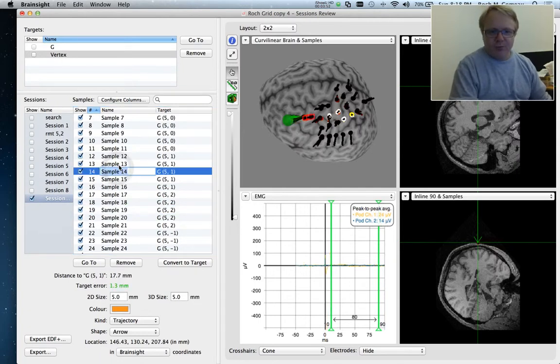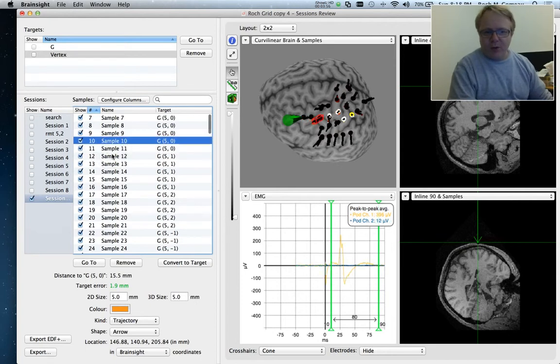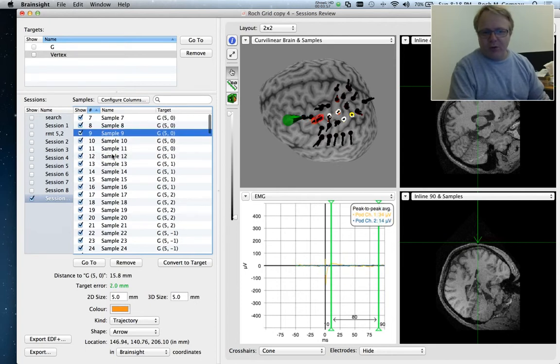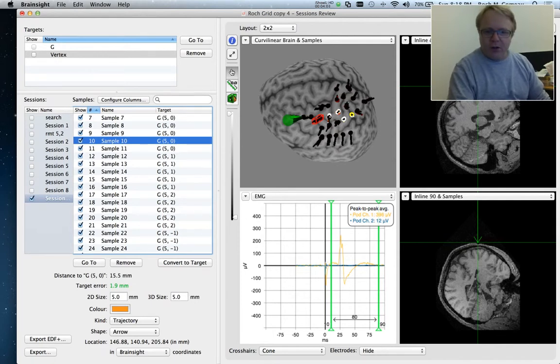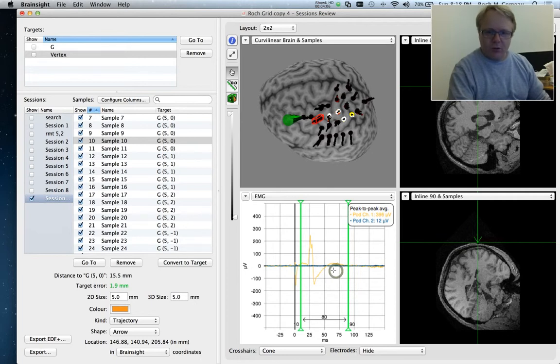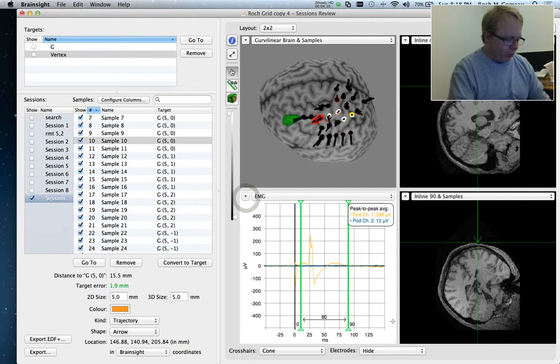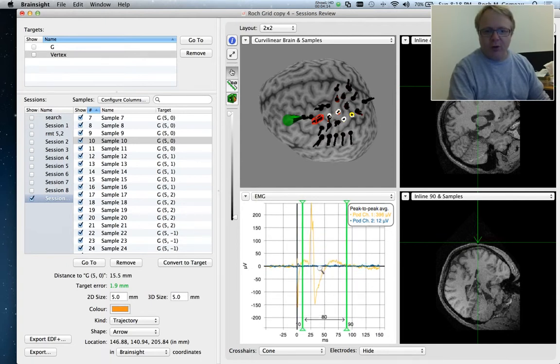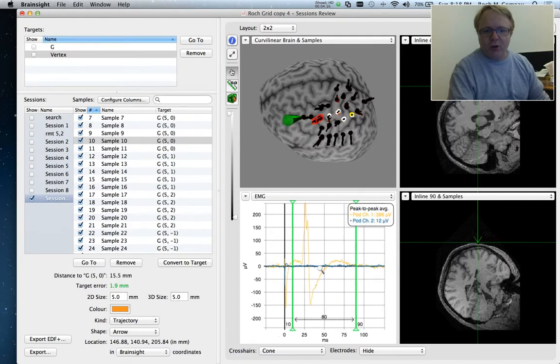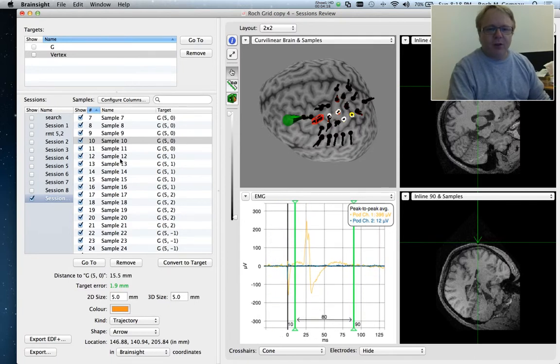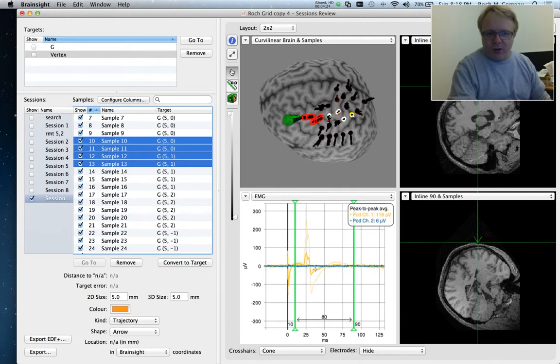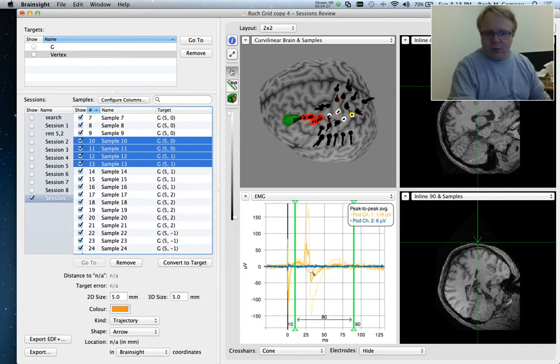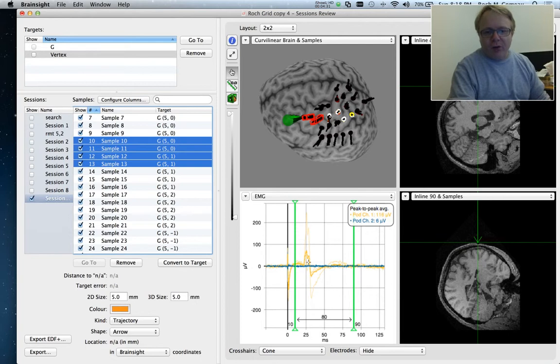Now I can simply, let me just rifle through some of these samples here. For example, we have a decent spike. Now I can use the zoom controls here or option scroll. So I can zoom up on this. I can change the X and the Y zoom quite easily. Now if I shift click, just like multiple samples, we will show all the samples here. And in the dotted line, you may not see in the video, we show the average of all these samples.